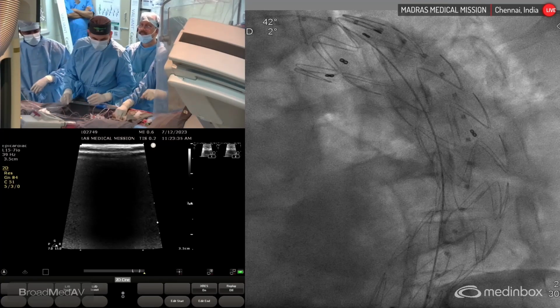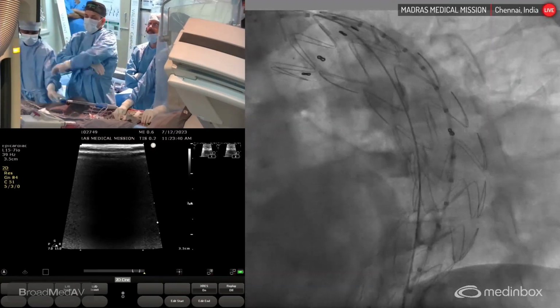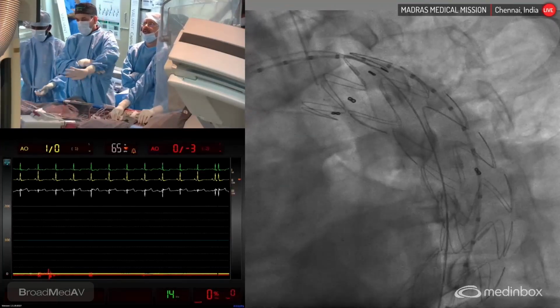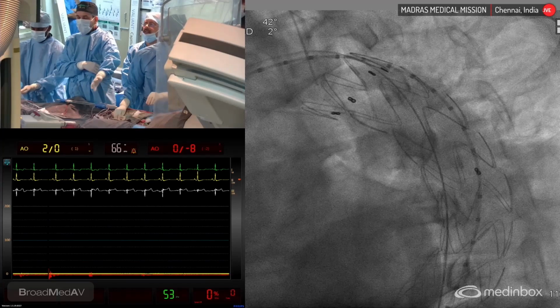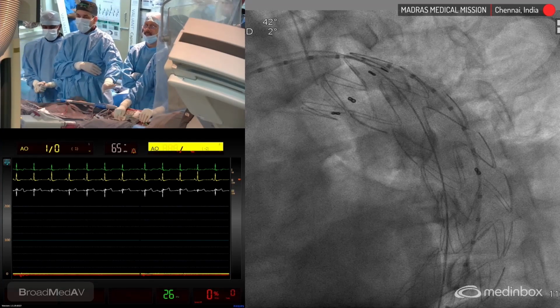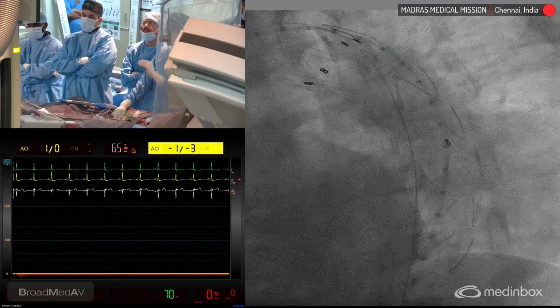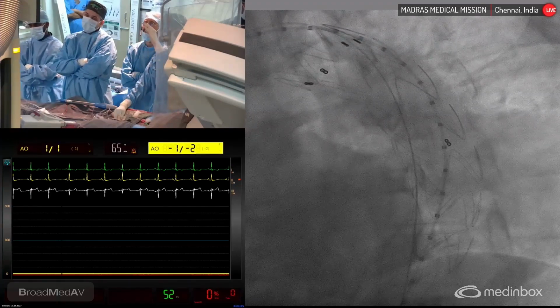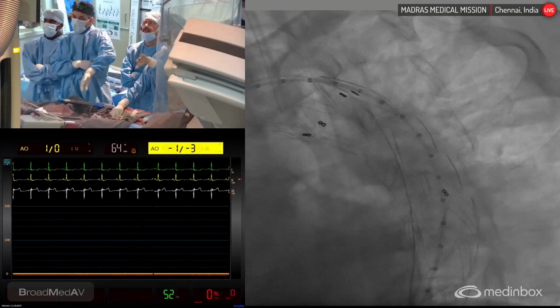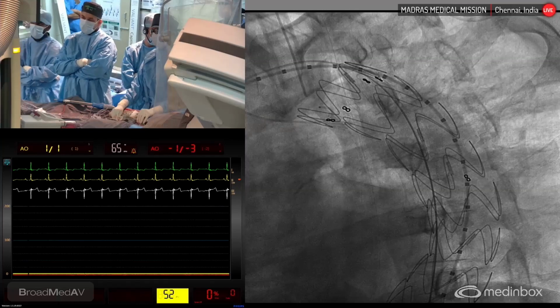Okay, before going to the next question, we will take a shot, fluoro. So show me the top of the device, make it center. Our target is only the proximal sealing zone to see for type 1A endoleak, and DSA. Stop breathing. You are ready? Maybe I think you just move a little bit above. Little above. And maybe this side a little. Okay, breath hold.